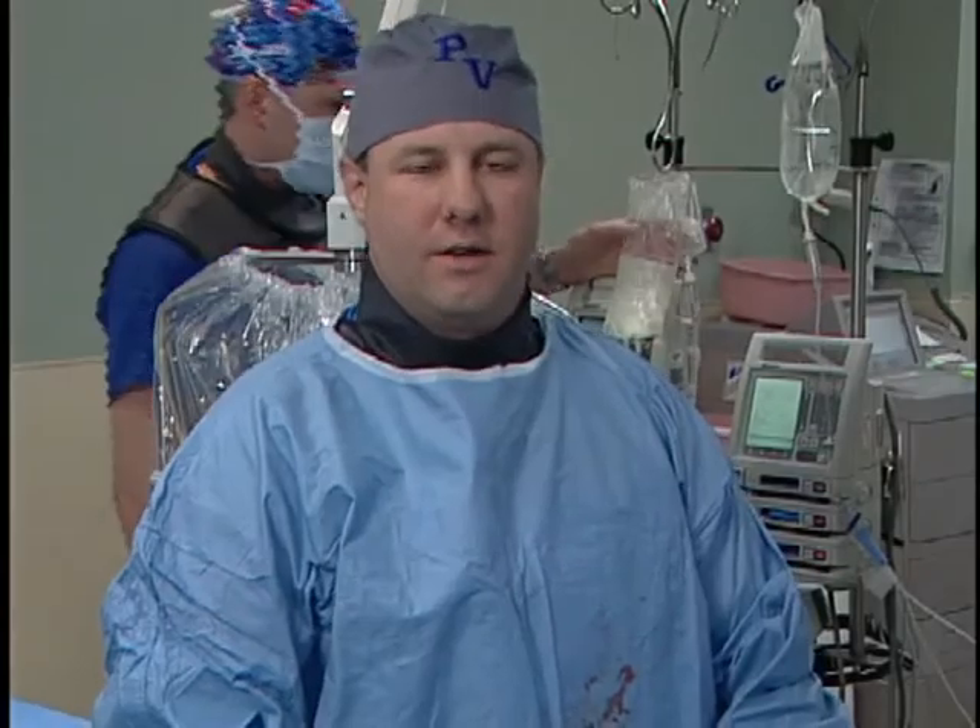This is an excellent example of a patient who has high-risk features for traditional carotid endarterectomy who underwent a very successful, uncomplicated procedure. I think that the Fibernet in general is an excellent filter for these cases. The profile is very low on crossing. The three-dimensional fibers that fill up the artery will accommodate tortuosities and filter down to 40 microns, making it a really ideal type of device for these procedures.